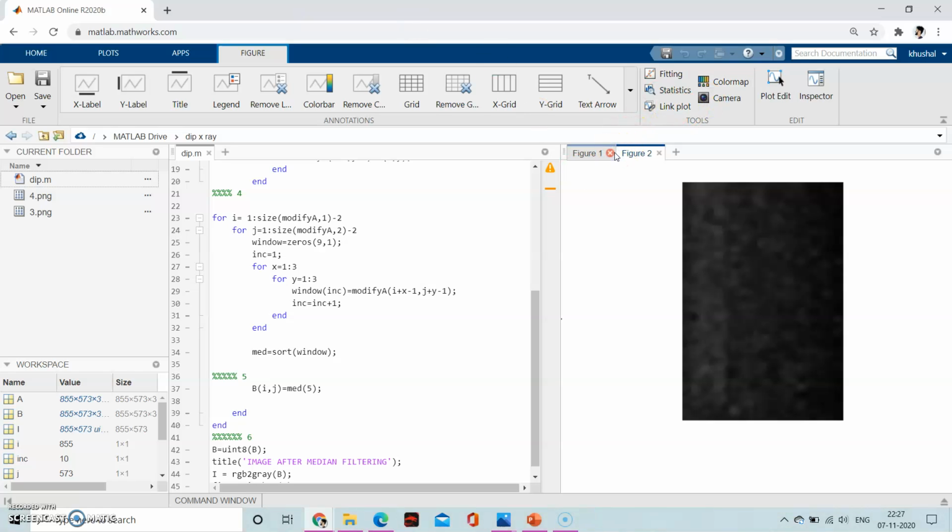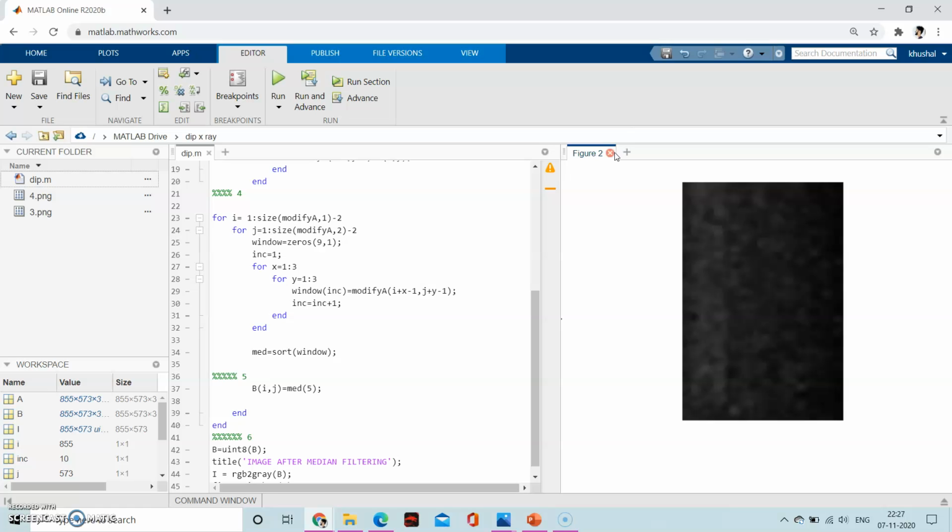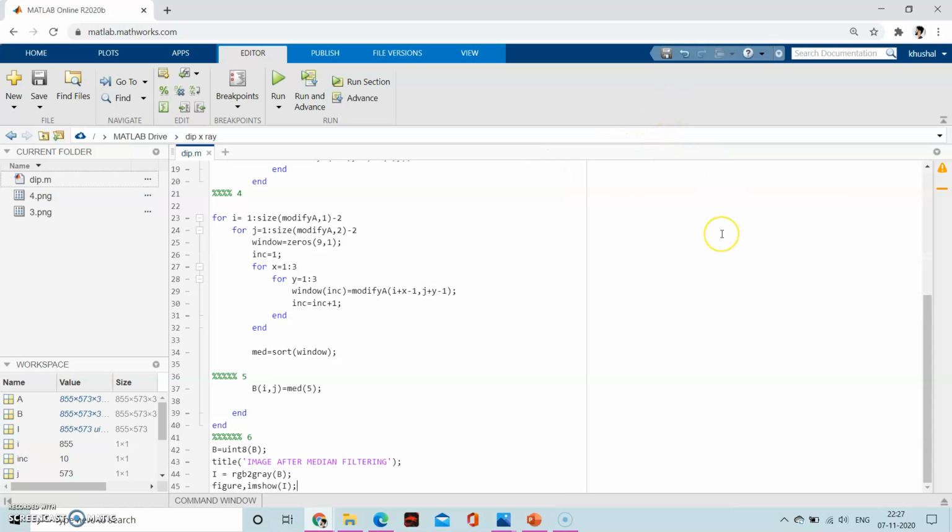Basically, my topic is based on medical applications, which we have already read in DIP, as DIP can be easily applied in medical applications. I am going to improve the image quality of our image by applying some of the algorithms and techniques which we have already read and studied in our course of DIP for this semester.